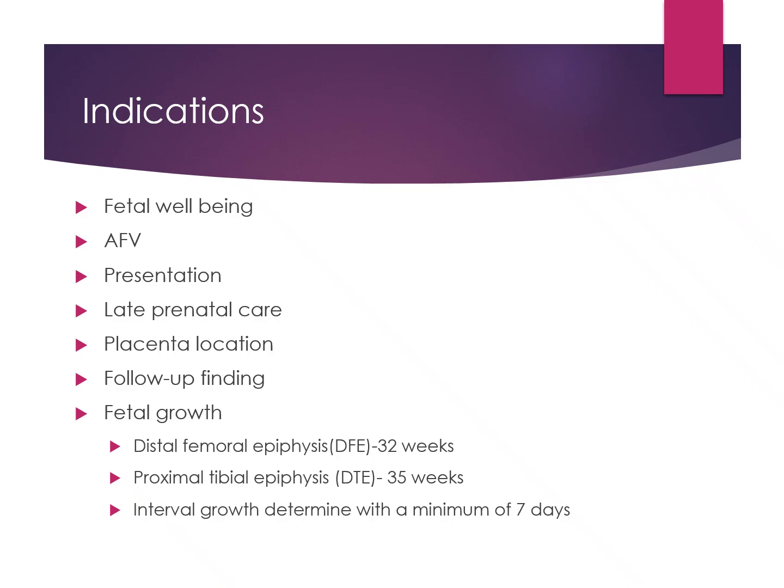And then the interval growth needs to be separated by a minimum of 7 days. We're not going to do it every day for 2 weeks. It's going to be 2 times in a 2-week period. 7 days, do it. 7 days, do it again.